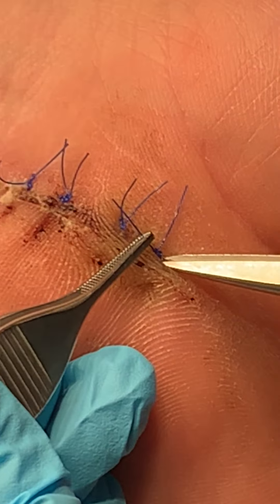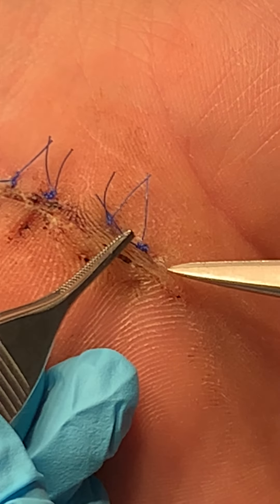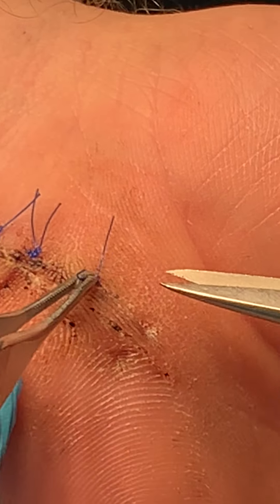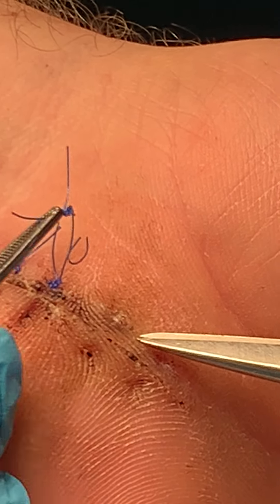there's one end here that is just under the knot — you just cut that, then pull, and the whole knot should come out together. Here again, holding the knot, pulling over, and just cutting right beside it and pulling out.